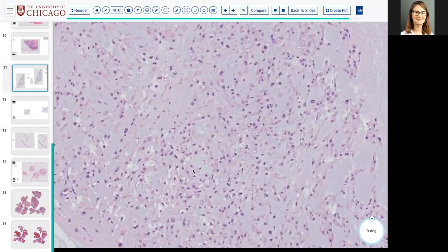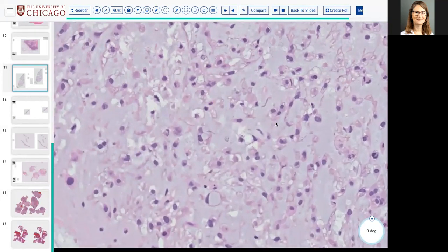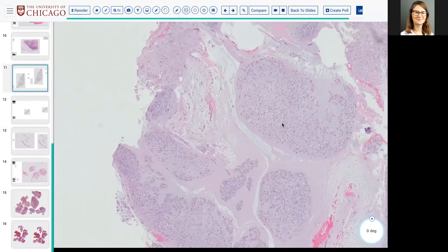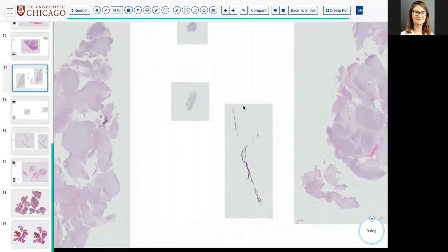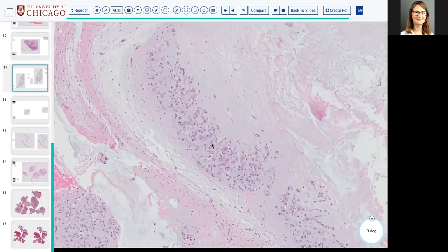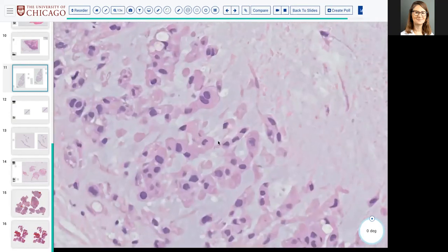And I think really having to investigate these tumors without knowledge of where they are can be very helpful because they can look like so many other things. And so, when you have this type of morphology, what immunos are going to help differentiate this from the other things we've talked about? So from a myoepithelial tumor and from a myxoid chondrosarcoma, or even from a myxoid liposarcoma, from a myxofibrosarcoma, tell me what do you want to order? What do you want to do? S100. Pardon? S100. S100, and what do you expect in chordoma?